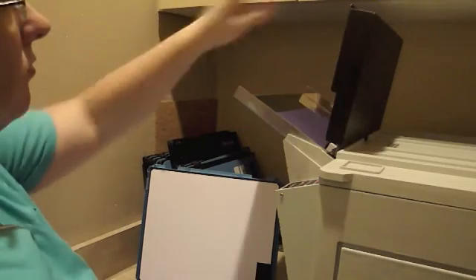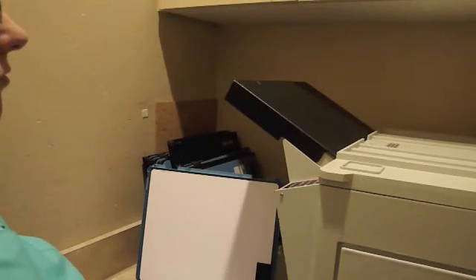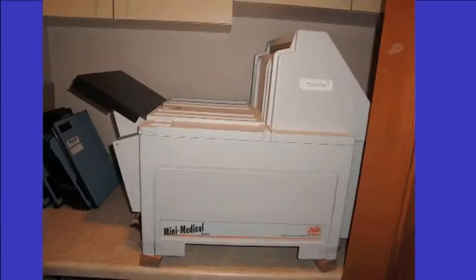If you need to develop more than one film, wait until you hear the beep. This will occur as soon as the first film has already been fed through. It indicates that you may load another film. Sometimes the machine may prematurely beep. After you've developed film enough, you'll understand the time necessary for one film to pass. If you hear a beep very soon, just wait. You'll hear a second beep.